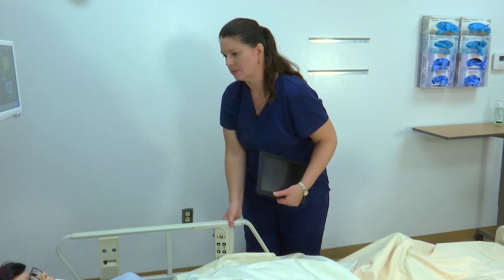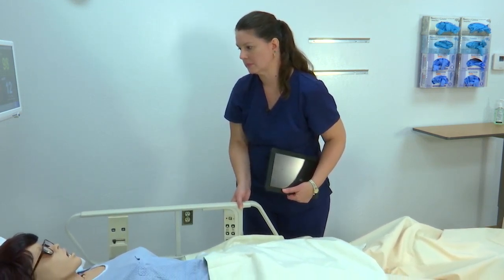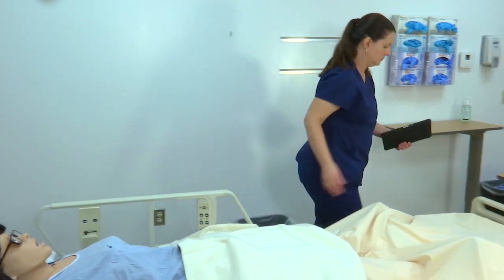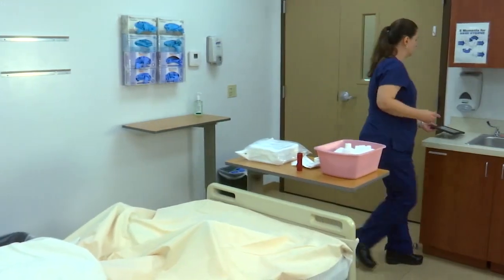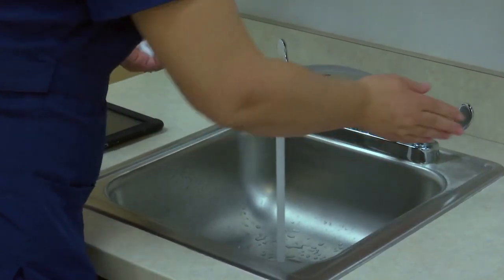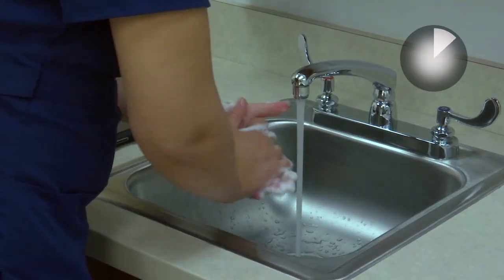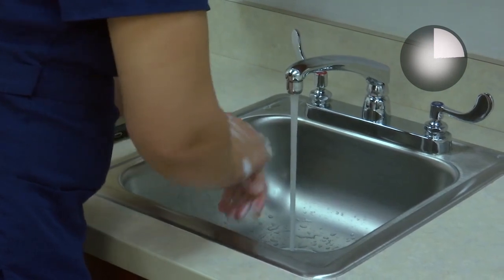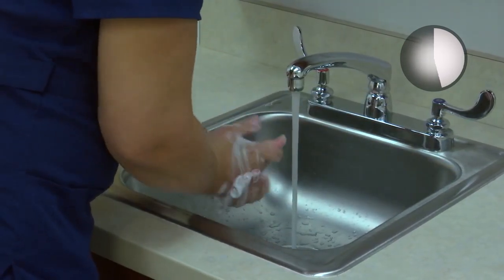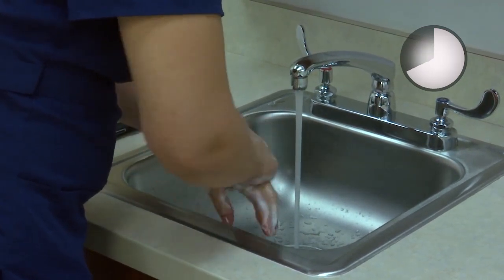Raise the bed to a comfortable working height. Before you begin, wash your hands, remembering to scrub for a full 20 seconds. According to Potter and Perry, the friction of rubbing hands together removes soil and transient organisms from the hands. Contaminated hands of healthcare workers are a primary source of infection transmission in healthcare settings.